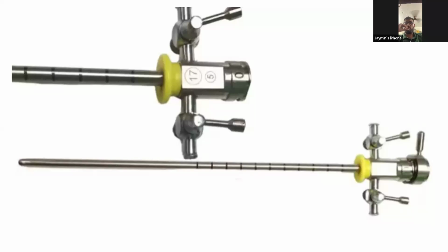Go systematically. You cannot do any diagnosis in the urethra? Sir, in case of stricture urethra, we can locate the site of stricture, sir. And also we can identify any urethral calculus, sir.